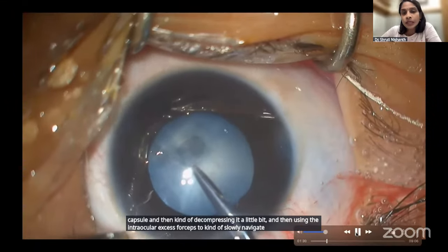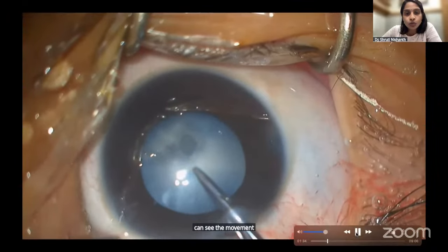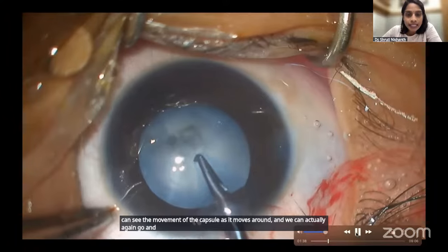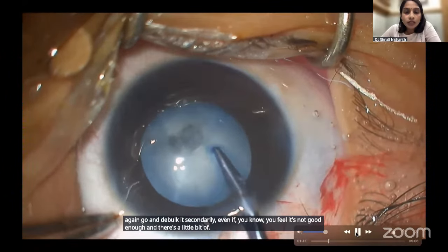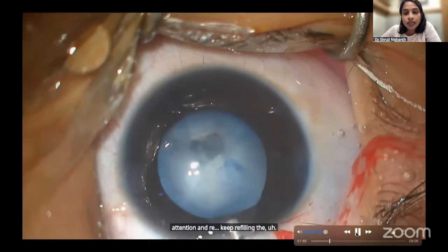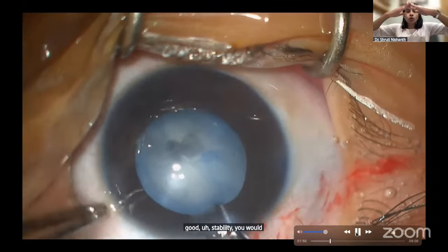And I'm deliberately putting these videos in slow motion so you can see the movement of the capsule as it moves around. We can actually go and debulk it secondarily, even if you feel it's not good enough and there's a little bit of tension, and keep refilling the high molecular weight viscoelastic. So you have this kind of good stability. You would like to even make it go concave.